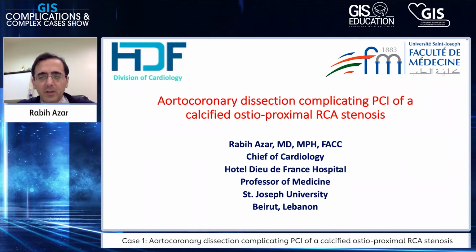And I'm going in the next 10 minutes to discuss with you this interesting complication that occurred during PCI of a calcified ostioproximal RCA stenosis.